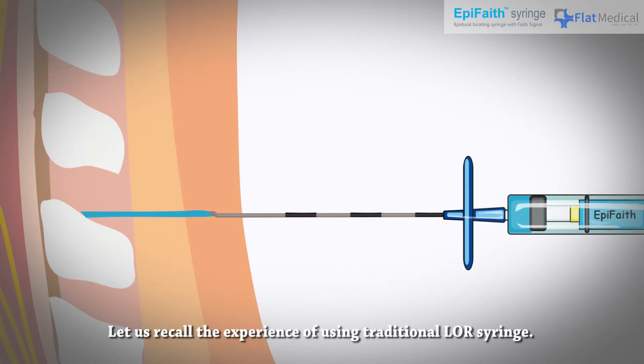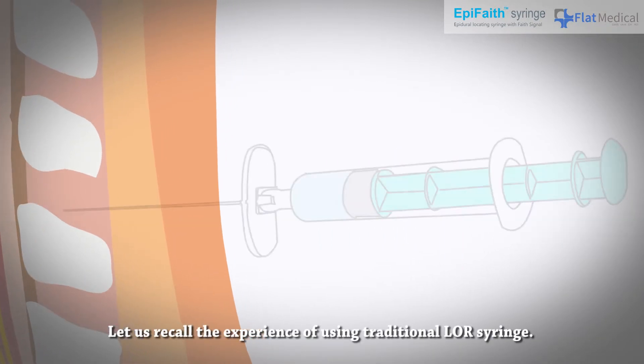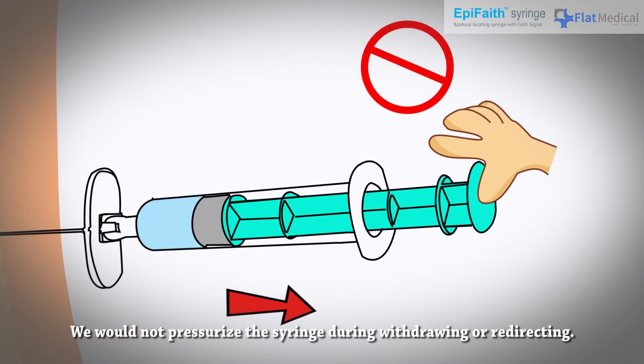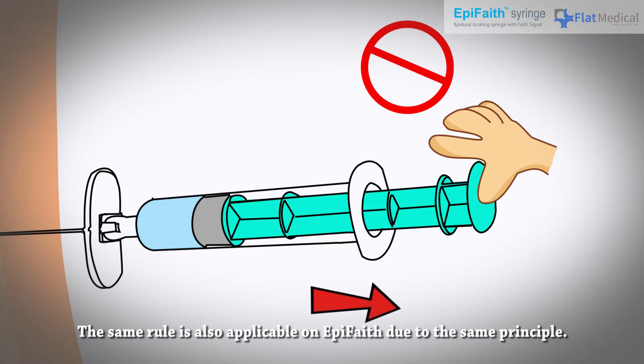Recall the experience of using a traditional loss of resistance syringe — we would not pressurize the syringe during withdrawing or redirecting. The same rule is also applicable to AppaFaith due to the same principle.